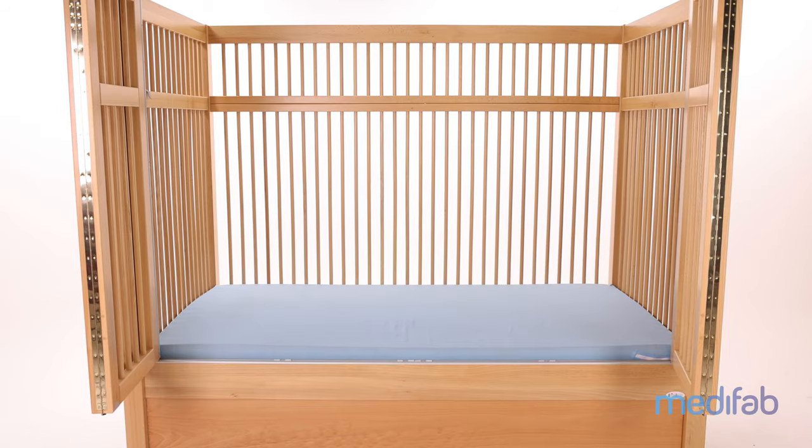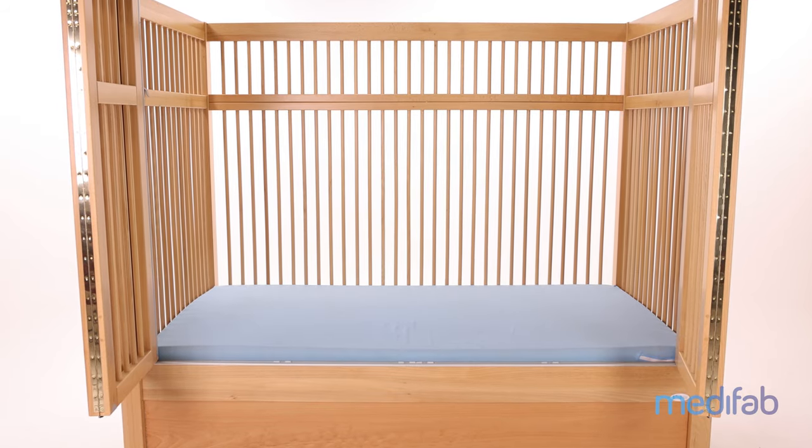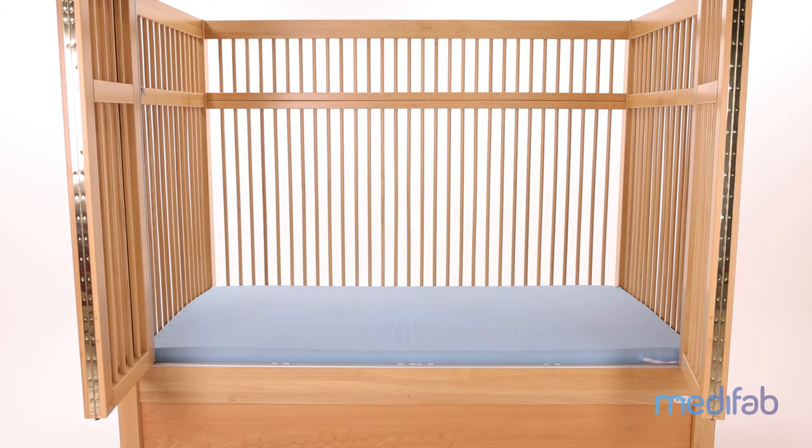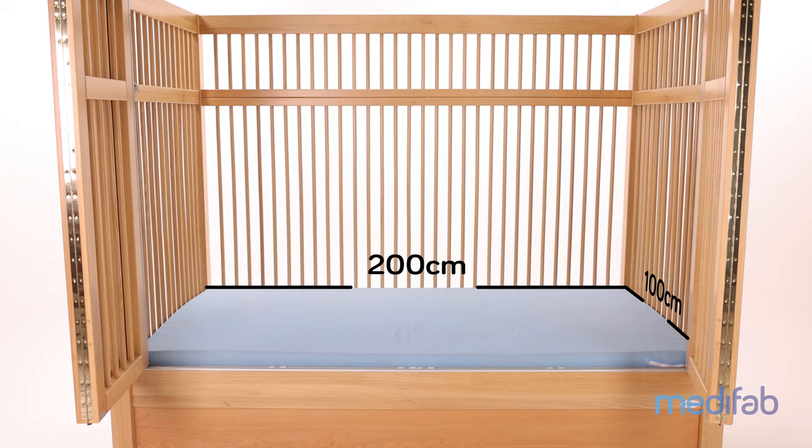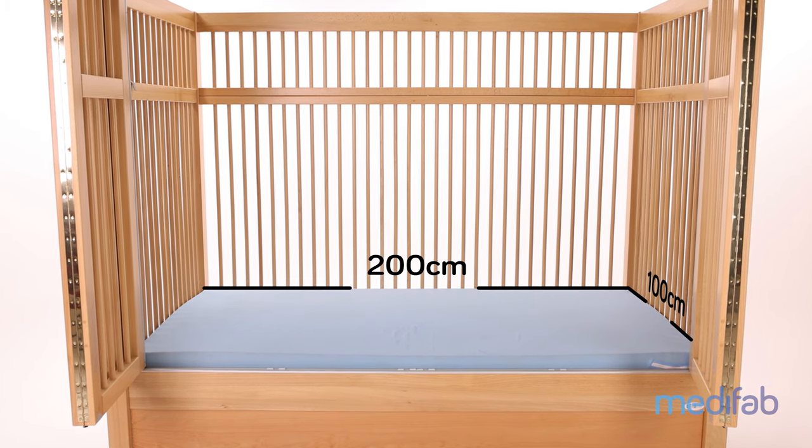Now let's look at the internal dimensions of the bed. Both beds are a similar size to a king single — the mattress measures 200 centimeters long by 100 centimeters wide, which means king single sheets will work well. There is plenty of room for you to lay down with your loved one for story time or to settle down for sleep, provided the combined weight is under 150 kilograms.